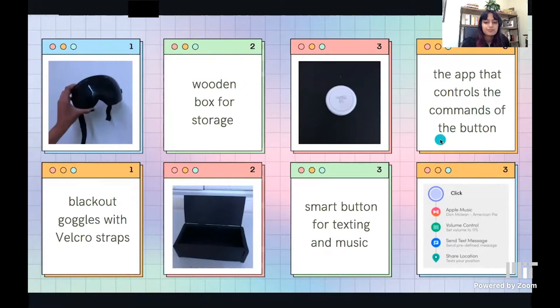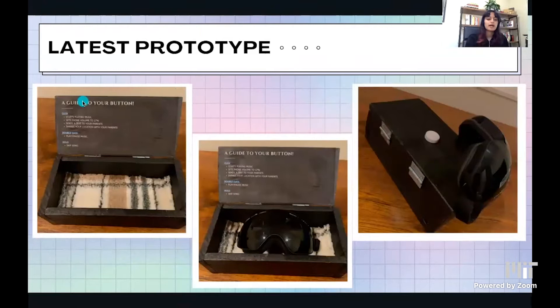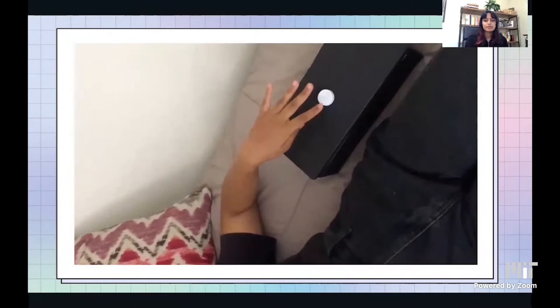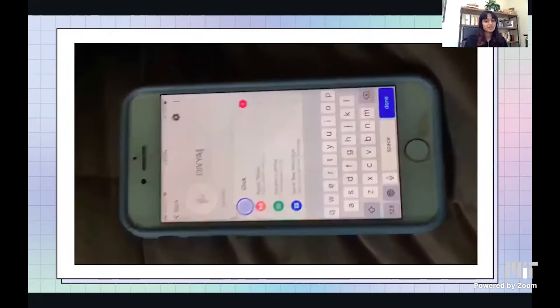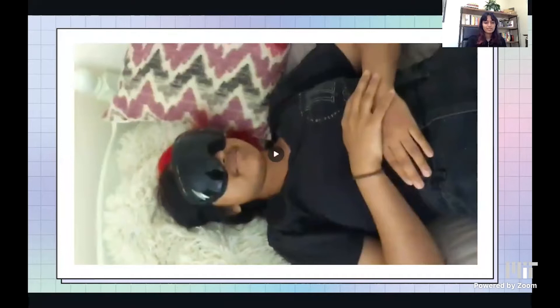Here is my final latest prototype. I added a little guide to the button so that Divya would remember what each click does. The double click and the hold are just for music controls because she mentioned specifically that music really helps during a migraine. I added padding on the bottom of the box so the lenses won't be scratched. Here is Divya actually using the product in bed, where she'll mainly be using it since she'll be sleeping. With just one click of the button, she puts on the glasses, it sends a text to her parents with location, and starts playing music. It's just a really simple way to make migraines a little bit easier.